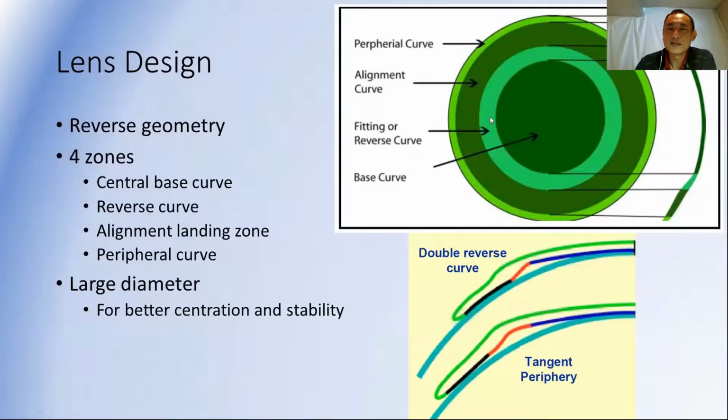The pupil size, I think, is only important in that you want to have some of this peripheral light that's going through this steep zone in the mid-periphery of the cornea to get into the eye for myopia control. If it's not for myopia control, that's probably not important. And in fact, the smaller the pupil, the better their vision will be for distance, because they're not seeing through much of this steeper cornea out here.